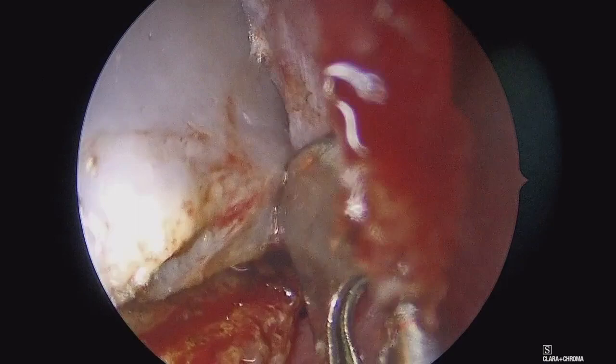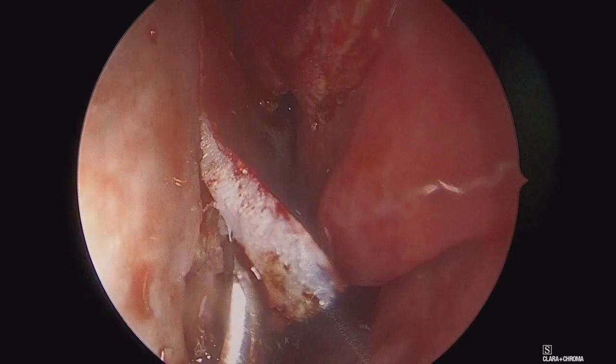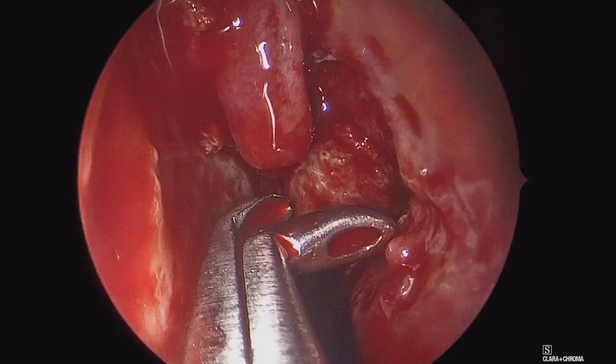Here is the flap being raised from anterior to posterior, once again on the left side. We're going to begin to access the posterior aspect of the nasal cavity by completing a posterior septectomy to facilitate binostral access. Once the flap is fully raised, we'll tuck it into the left maxillary sinus to keep it out of the way throughout the case.